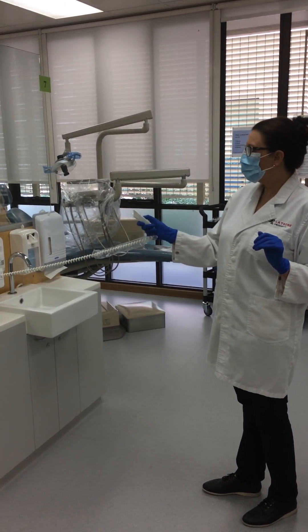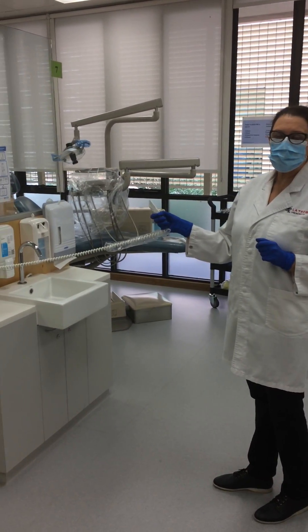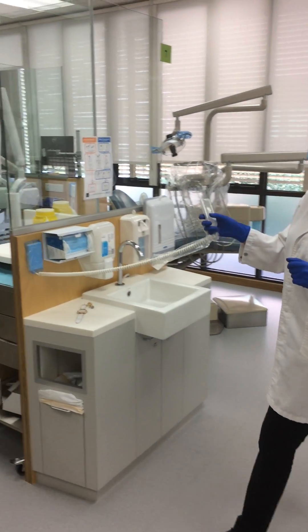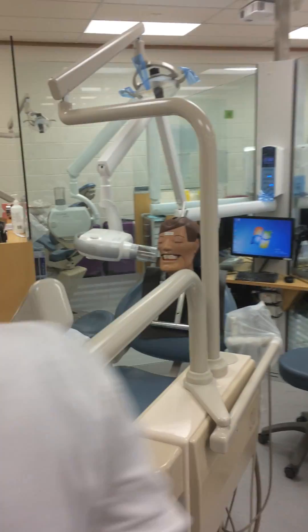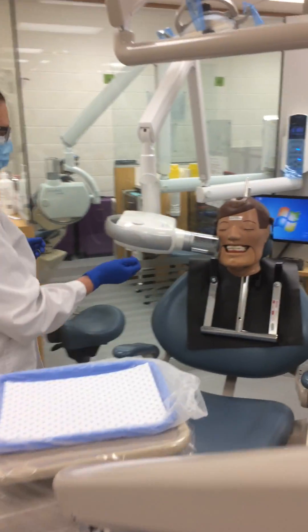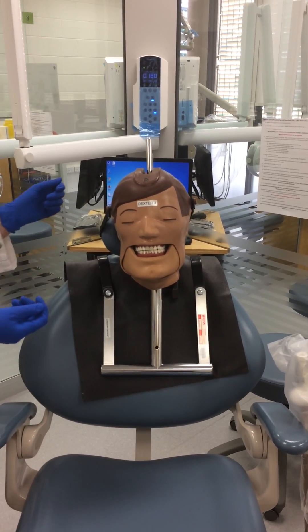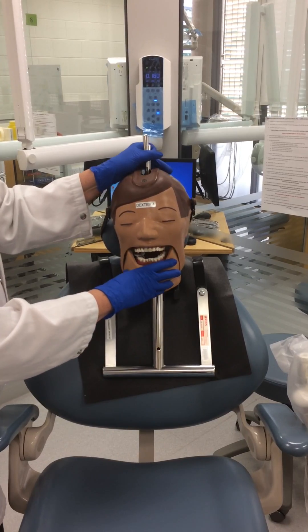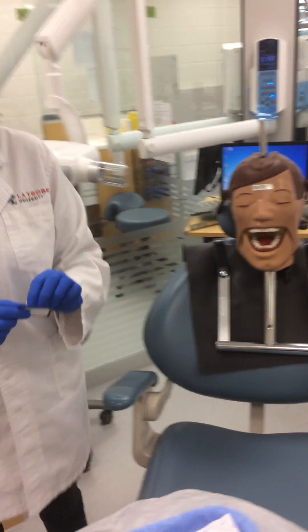You press the button and the radiograph has been exposed. You place this back, then go to your patient and move the X-ray head or PID away. You open up and remove the phosphor plate.